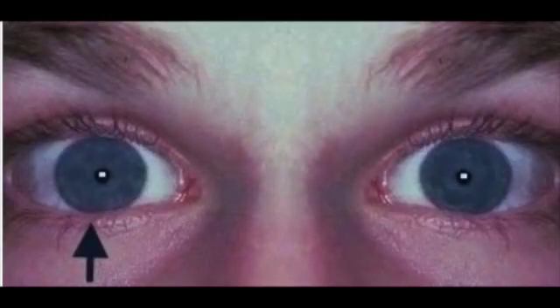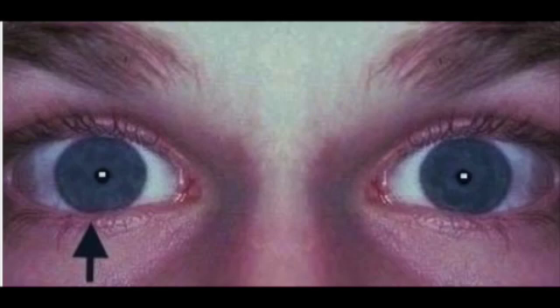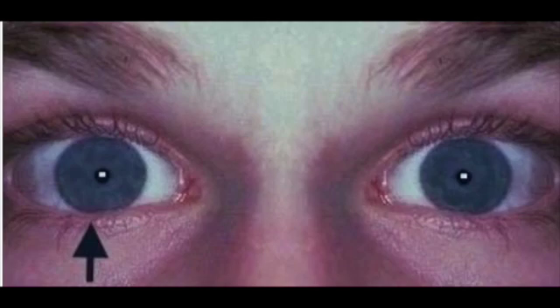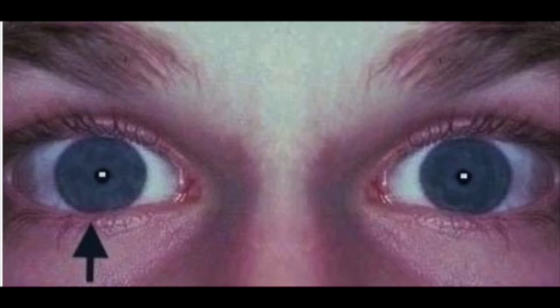For purposes of this video, the right side will be the patient's right side and the patient's right eye. The left side will be the patient's left side. Don't be confused when I say right and left — I'm speaking about the patient's right eye and the patient's left eye. The arrow here is pointing to the patient's right eye, which happens to be on your left.